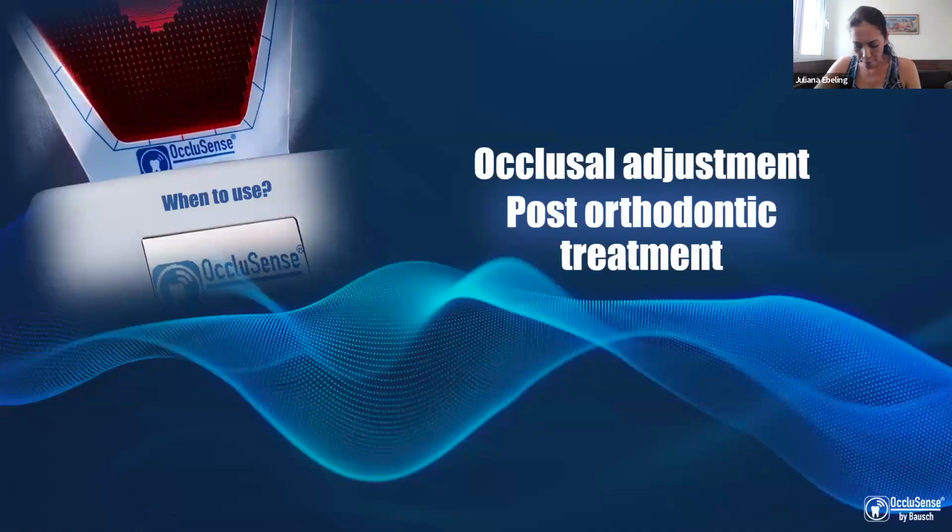Now I have been receiving a different demand, which is orthodontic treatment with aligners, and we are having many problems with the finalization phase of this treatment, because we know that aligners are not able to make a very good intercuspation, and we have many adult patients with worn teeth, with no good anatomy to reach stabilization.